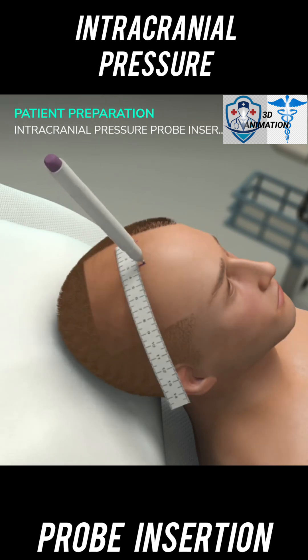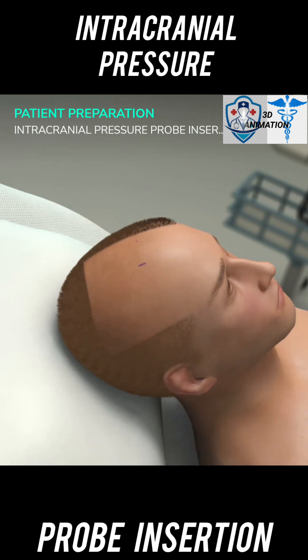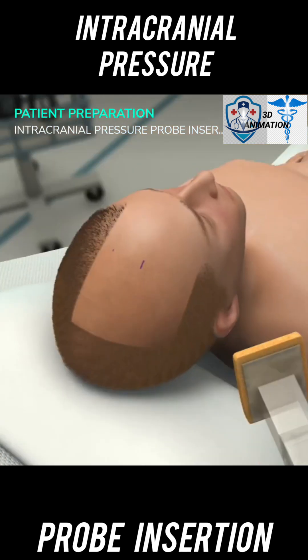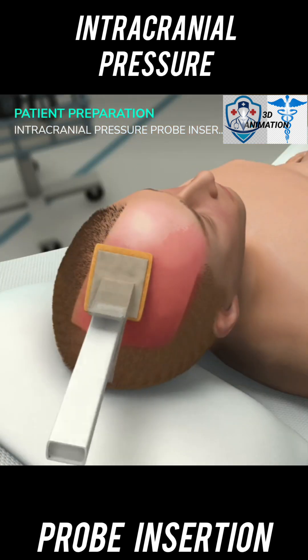Using a pen and ruler, mark the incision 2 centimeters from the midline, behind the hairline, aligned with the mid-pupillary line and 2 to 3 centimeters in front of the coronal suture. Check that the incision is in the mid-pupillary line. Use chlorhexidine scrub to prep the site for 60 seconds.